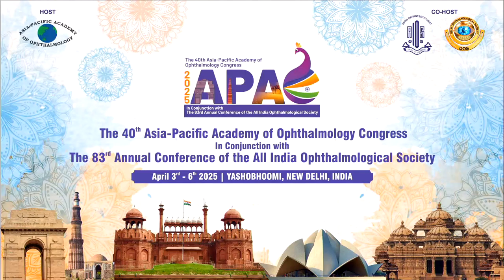Dr. Vinay, what about you? Sir, I think this fluid thing is more about AMD, and the challenge that we've seen with periodic injections of anti-VEGF is that sometimes they go into geographic atrophy. So if you're trying to chase and remove each and every droplet of fluid, you may end up causing more geographic atrophy.